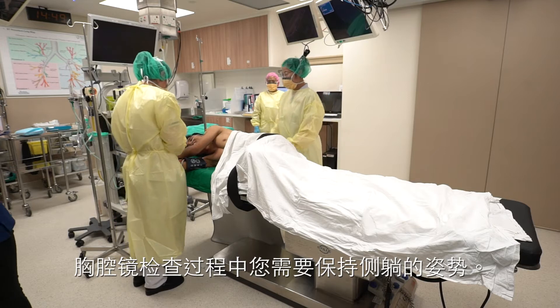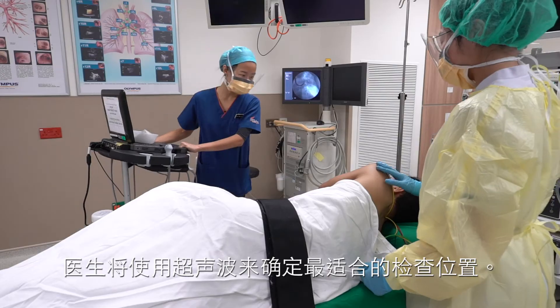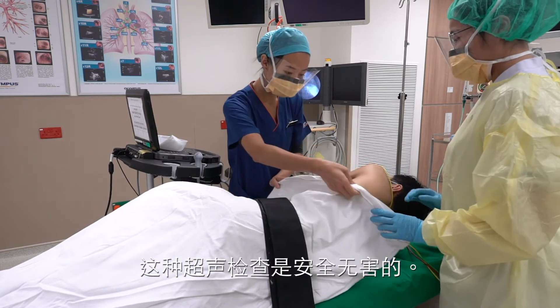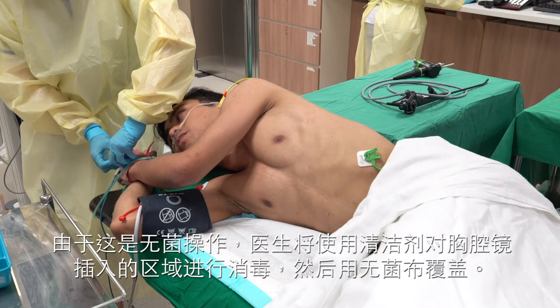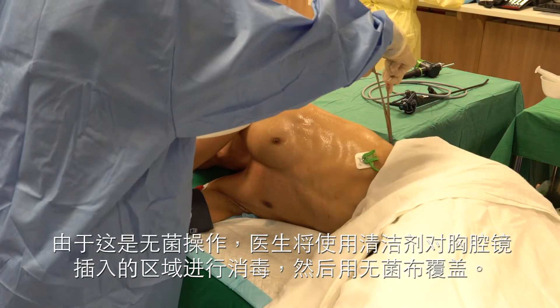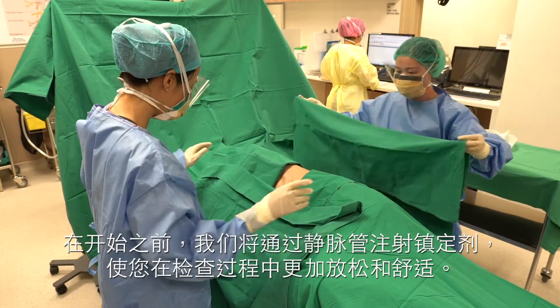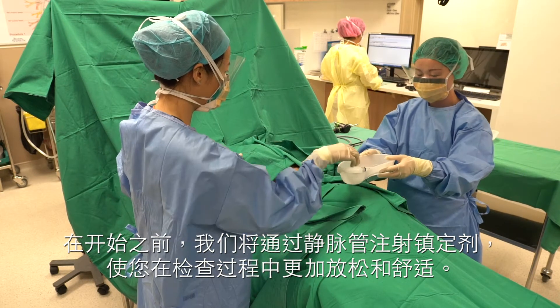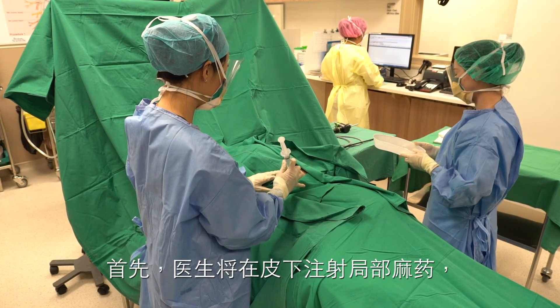The thoracoscopy will be performed with you lying on your side. An ultrasound exam will be carried out to determine the suitable site for the procedure. This does not hurt, but the gel can be cold. As it is a sterile procedure, you will be cleaned with cleaning solution and covered with green sterile towels.